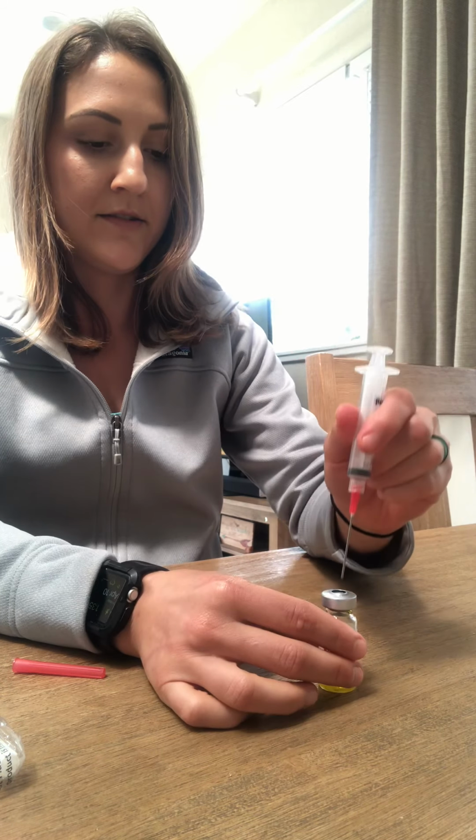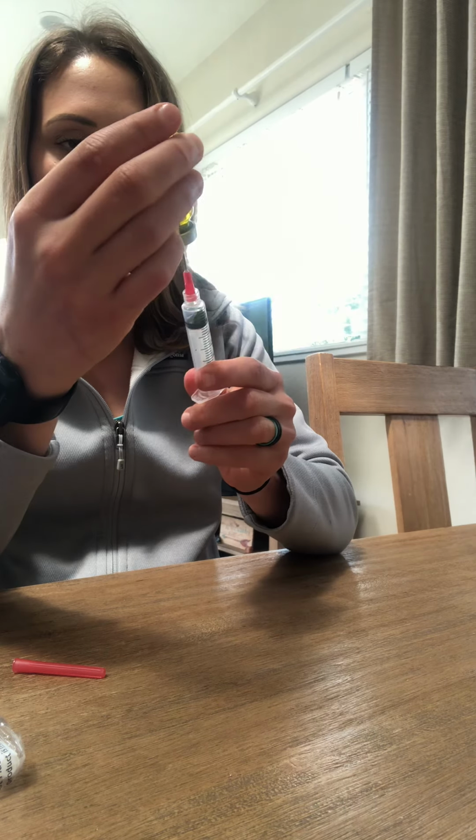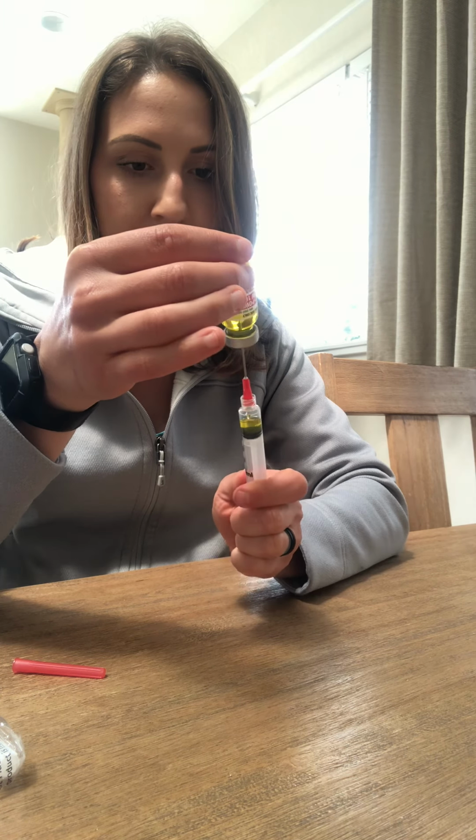And then I'm going to take a new sterile alcohol swab and cleanse that. And then I'm going to be letting it dry, inserting the needle, and drawing back the amount of medication that I need.